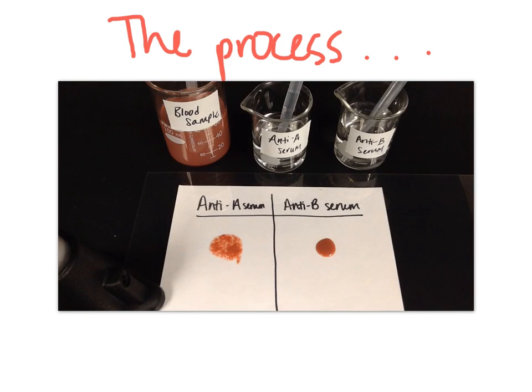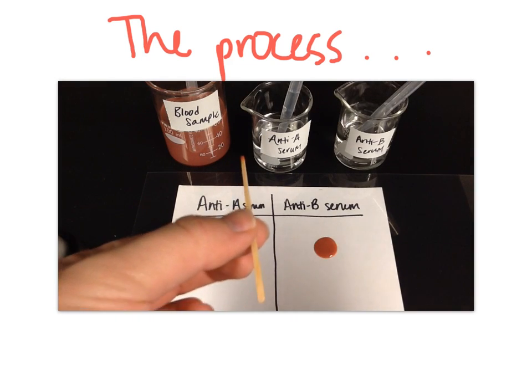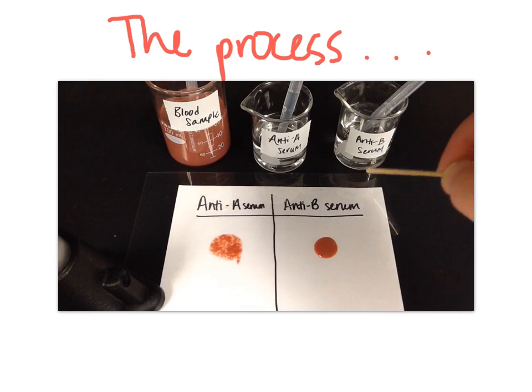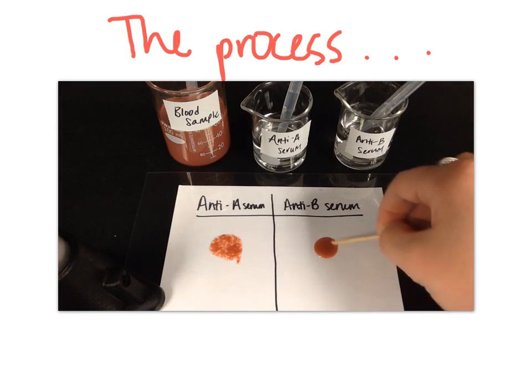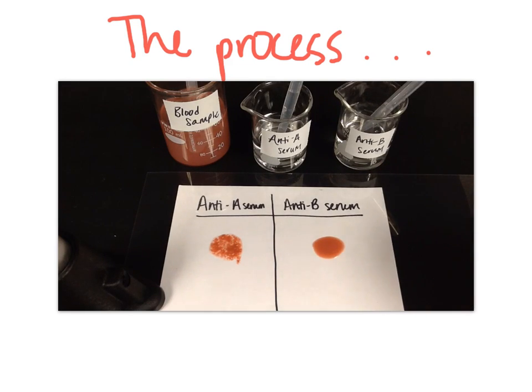So let's do anti-B and let's see what happens. So again, I take my pipette, I put 2 drops of anti-B. Now I can use the other side of the toothpick because it's still sterile. So I'm going to mix the anti-B, spread it around a little bit. And there's nothing there. You can tell that these 2 substances look different.